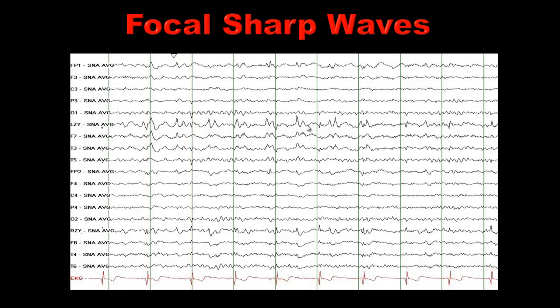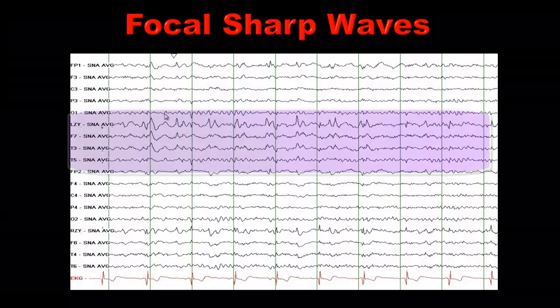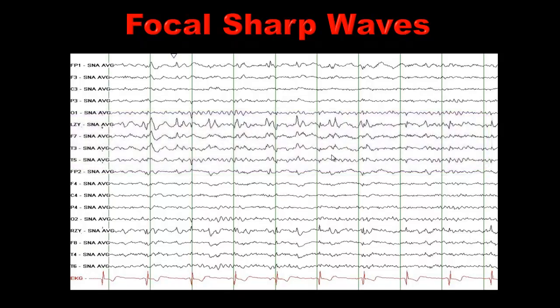Focal sharp waves — here you see the sharp waves in the left zygomatic and left temporal head region, and some sharps in the right temporal as well, though it's not clear if that's ECG artifact. These are sharp waves on the left side. The left temporal sharp waves are accompanied by focal slowing in the left temporal head region, which may be suggestive of an underlying structural abnormality there. The focal sharp waves are suggestive of an increased risk of seizure onset from this location. This is an average reference montage, and you can also review it on a bipolar montage.